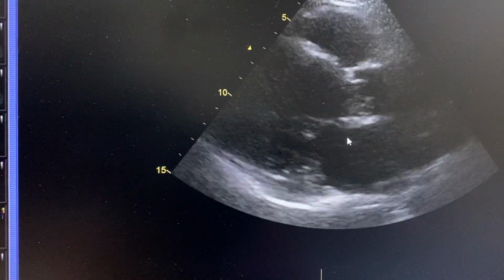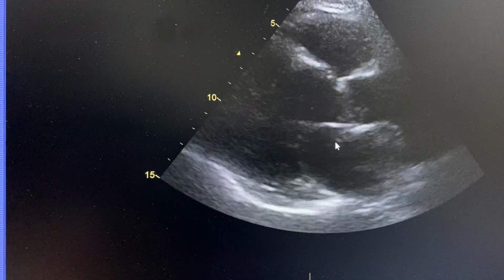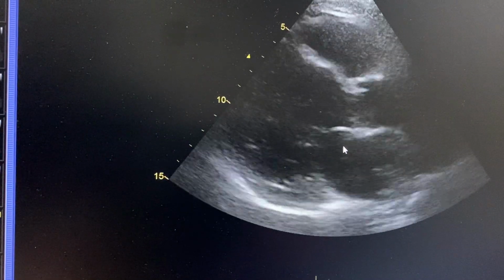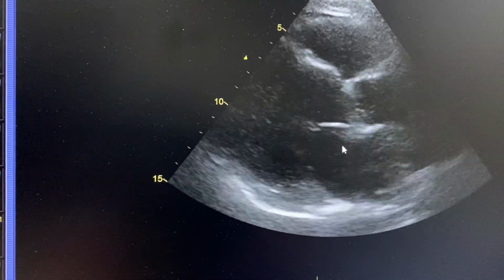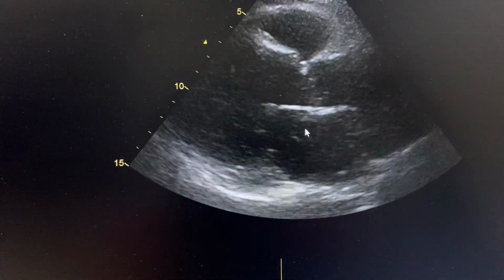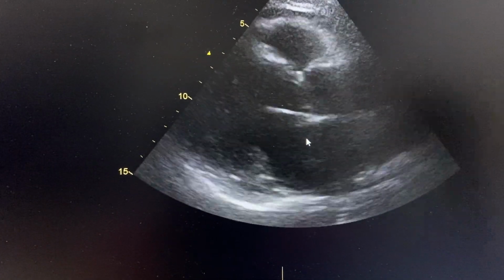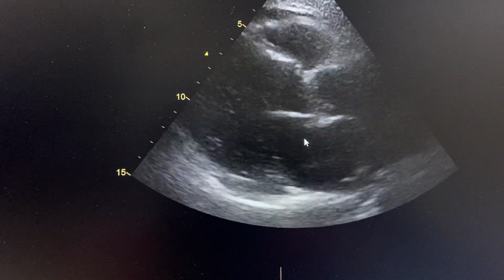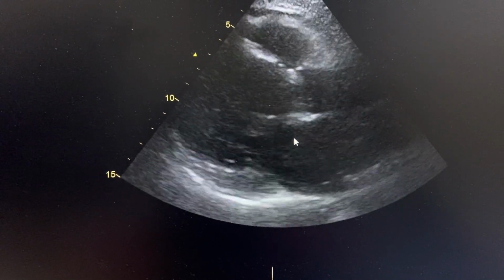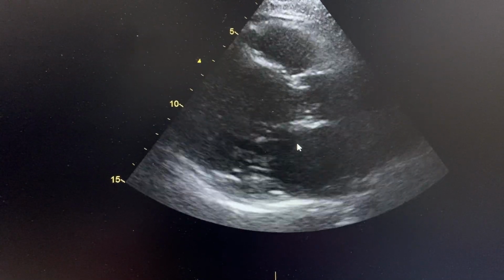And then for the anterolateral wall, for example, if there is occlusion before the diagonals, the anterolateral wall will be hypokinetic. It's simple as that. It is so easy for wall motion abnormalities. You have to read. I'll make a clear video about this. I just wanted to show you what wall motion abnormalities look like. Maybe in the future, when I get someone with a very good window, I will show you very clear images.